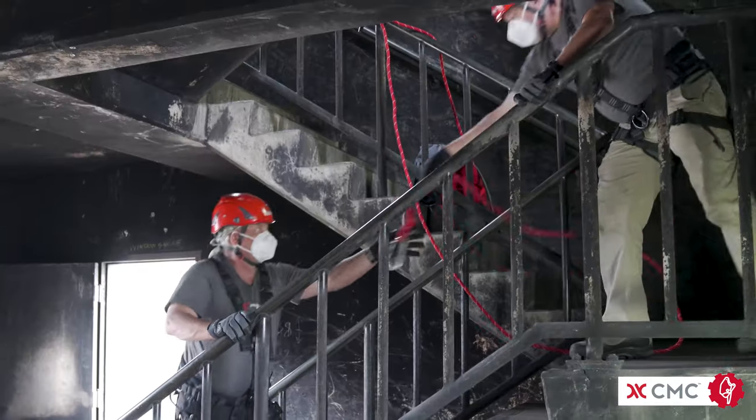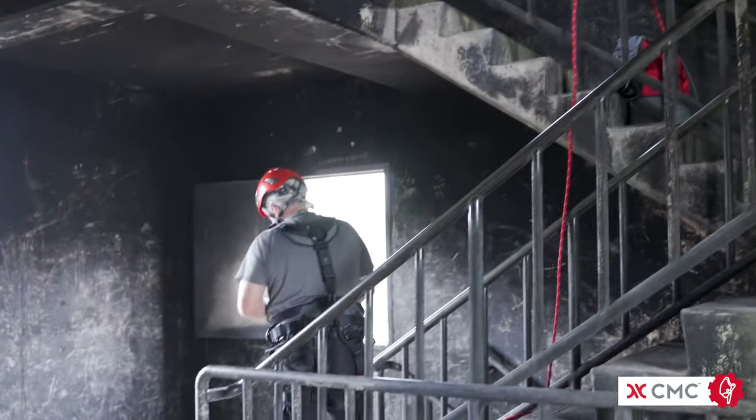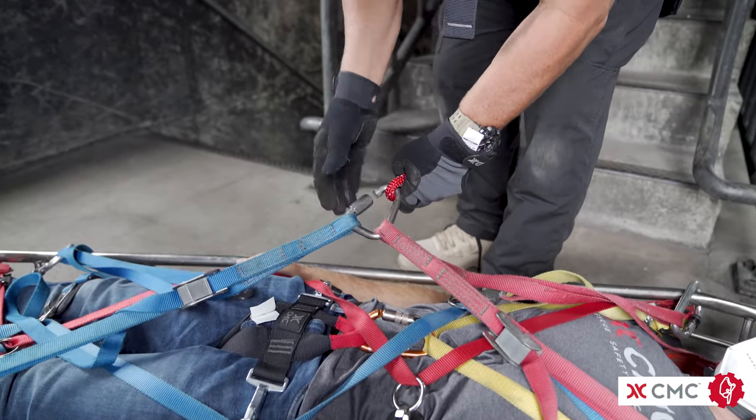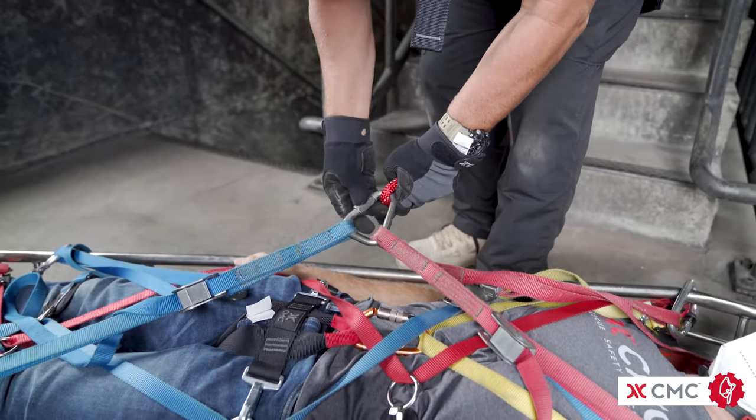After patient packaging is complete, take the working end of the rope and attach it to a litter bridle. The legs of the bridle should be shortened as much as practical once attached to the litter.